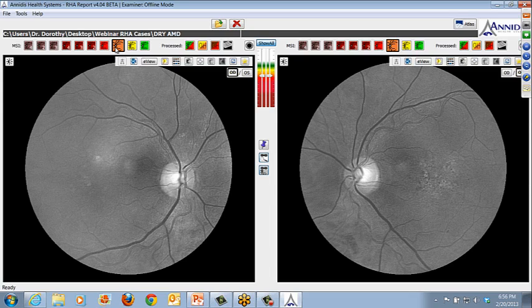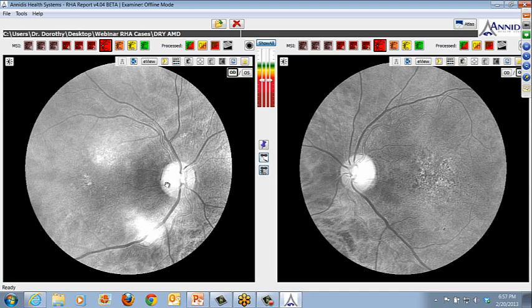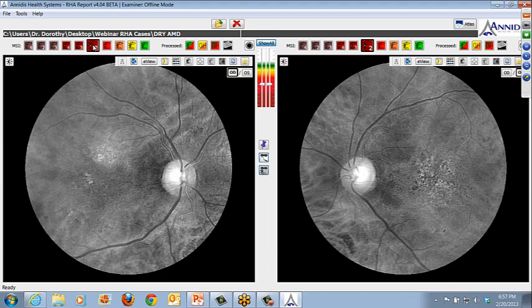You really need the full spectrum in a nicely dilated pupil with good, technically reliable, and obtained images, such as you have here. And again, you're going to see some technical issues in some of these, and I actually left these in here on purpose because on this particular image, the technician probably should have retaken this particular slice, okay? But nonetheless, you still have a number of other RPE views.